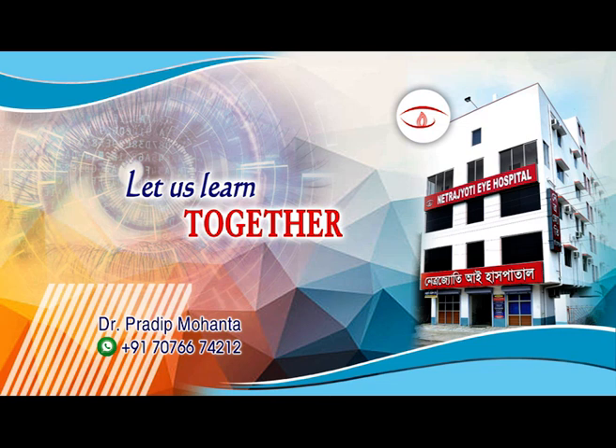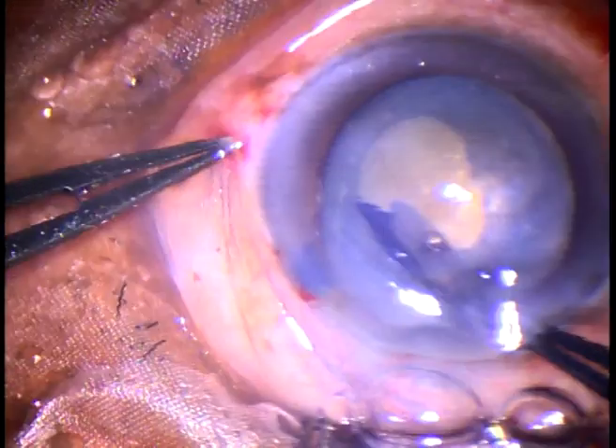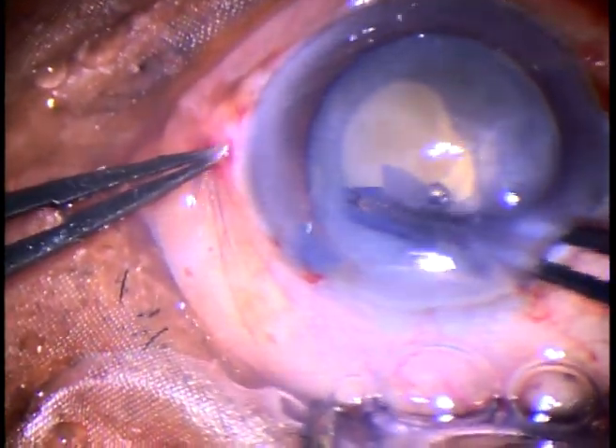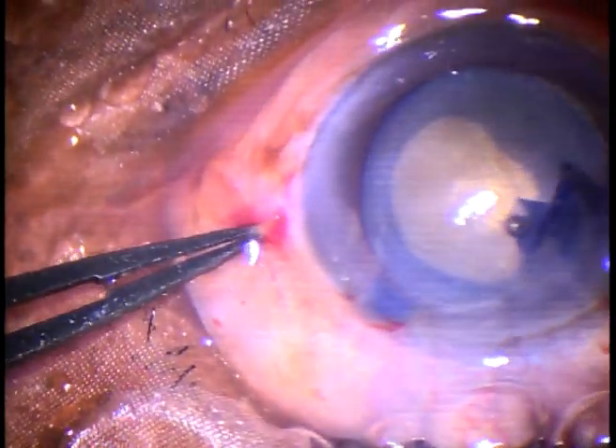Friends, welcome to my workplace at Ranaghat, West Bengal, India. This is a hypermature Morgagnian cataract. After aspirating the milky fluid, capsulorhexis is being done at this moment with the help of utrata forceps.